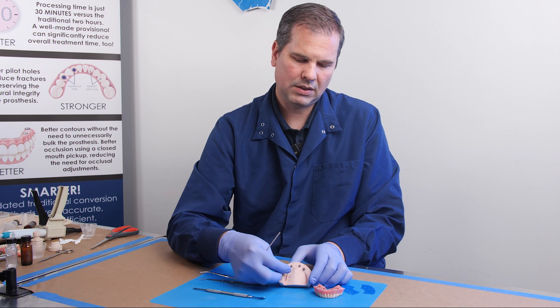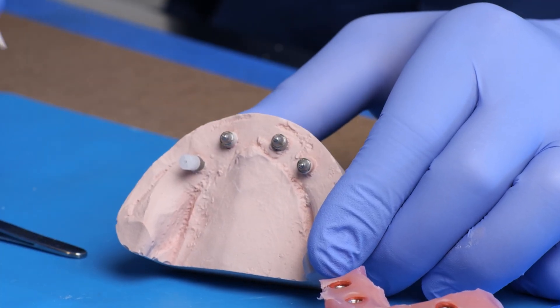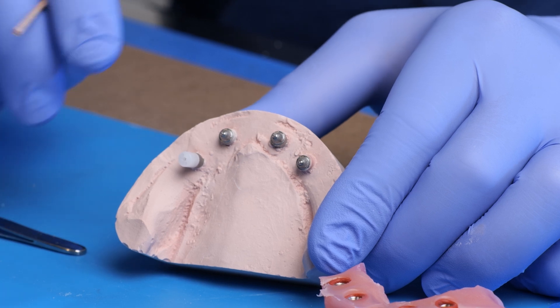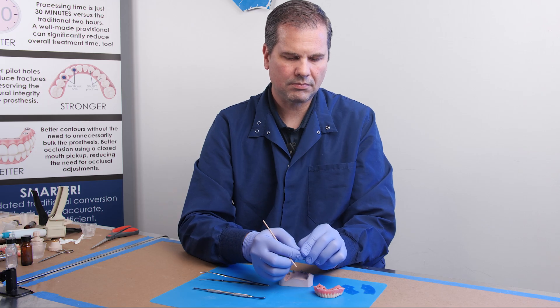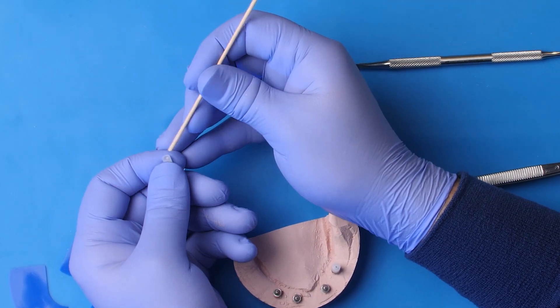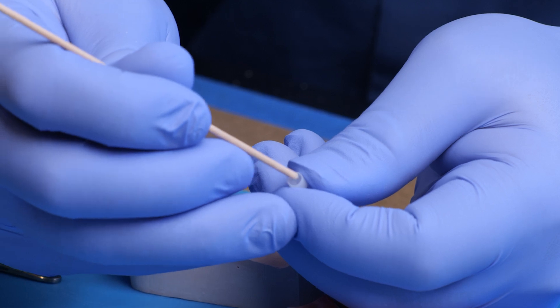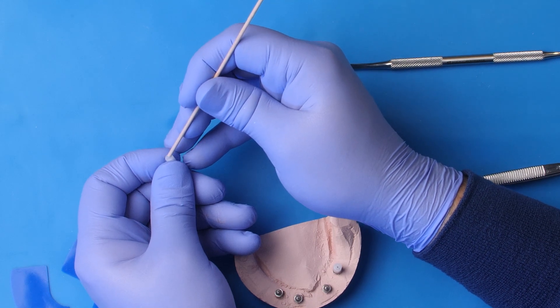Now I'm going to put this press-on cap and just push it onto the fragment that stayed behind in the multi-unit abutment. If you look at this press-on cap, this is the seating surface of the multi-unit abutment, and then this is the top of the press-on cap.